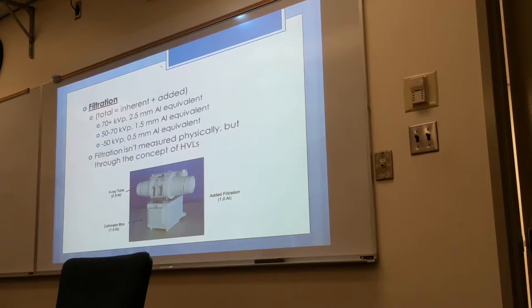Okay, is that good for the patient? Yes, it is. Because otherwise, if we don't filter out the soft rays, guess who's going to be filtering it? The patient. Okay? So we're going to filter it before it reaches the patient. So total filtration includes both inherent and added.